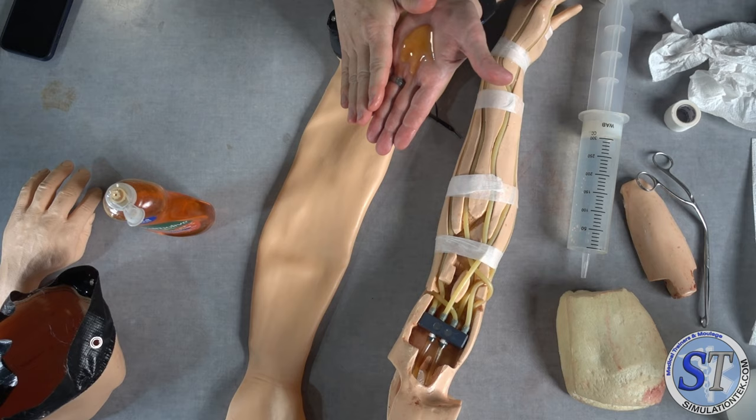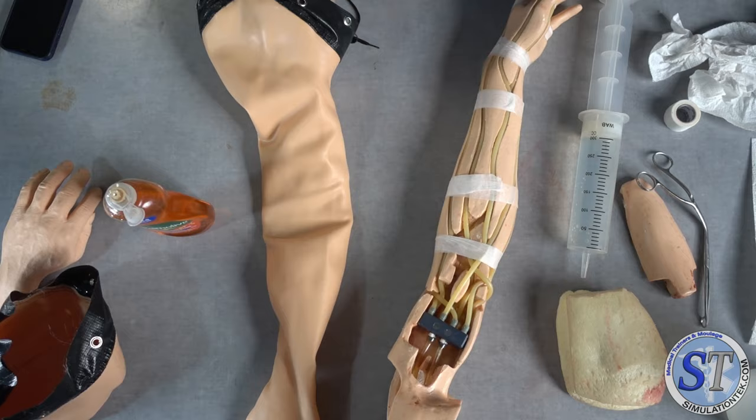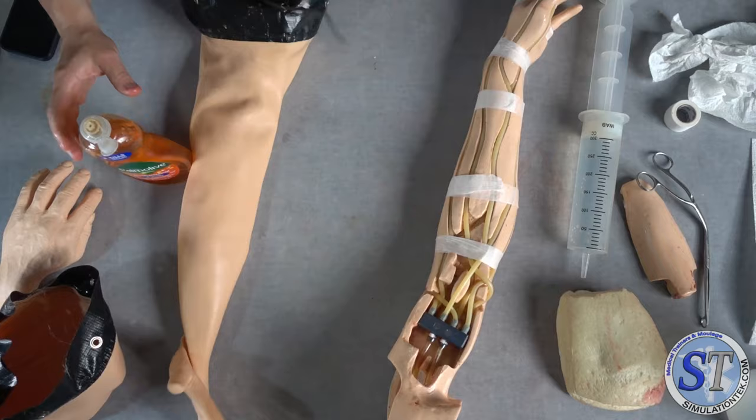So the first thing we're gonna do is start with your new skin. You want to add soap, you want to add water. So I've got that pitcher of water, I've got the soap. So I'm just going to cup my hand. And what I want to do is reach way up in there and get as much of this stuff lubricated as I can. Go all the way down to the wrist. Remember, the wrist and the fingertips are what will drive you mad. You want to kind of roll it around like this. Go in there. And I need more.